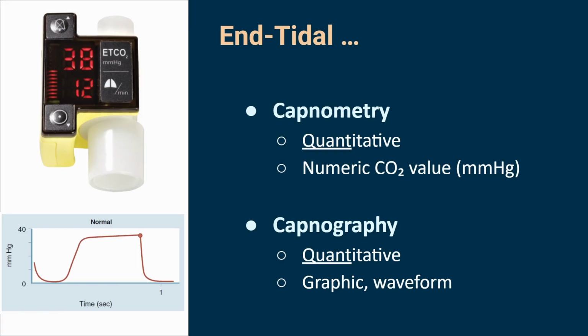Capnometry is the number. Capnography is the waveform. I don't super care that you know that, but it does cause a twitch in my eye sometimes on the truck when somebody's like, what's a capnometry? It looks like bronchospasm, and I'm like, well, that's okay. I know what you mean. That's okay.